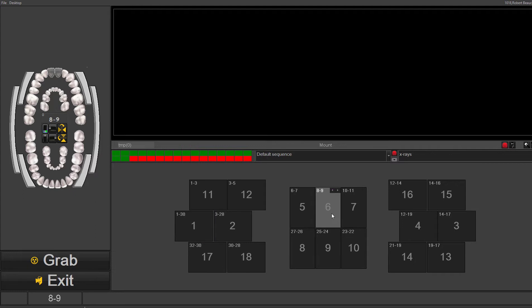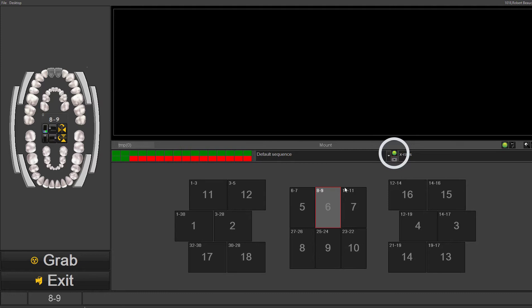You can just click anywhere you want to acquire the image, and you can take multiple images of the same tooth number. If you do, make sure that this button here is red. Red means stop on one. If you click on it, it turns green — green means go, meaning it will advance through the numerical sequence outlined in the full mouth series.